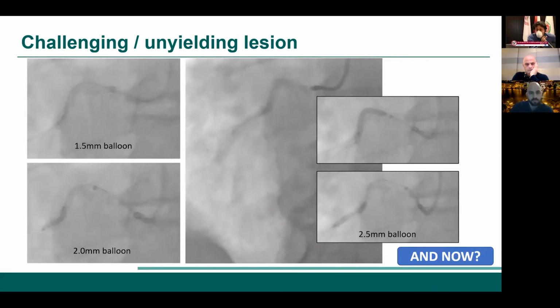I don't know what you think, Dr. Edis, Dr. Emil. That's an excellent case again. Taking a look at the image that is moving right now, I think that only the second lesion is the one that clearly requires rotational atherectomy. The prior one can be manipulated enough for it to crack the calcium arc and then eventually be stented.